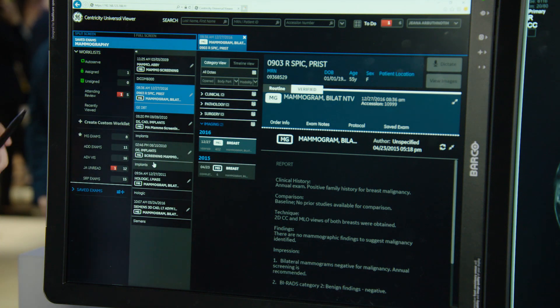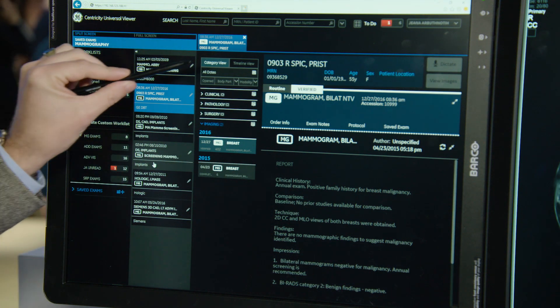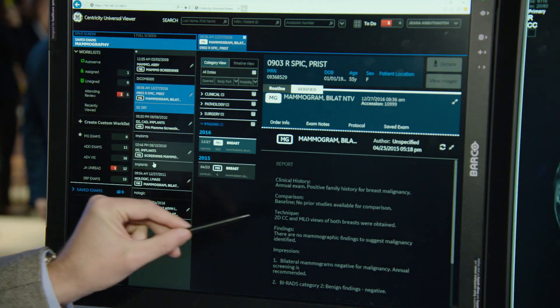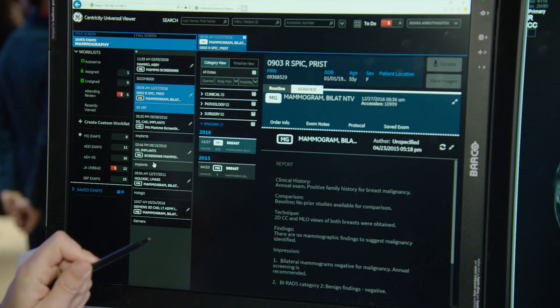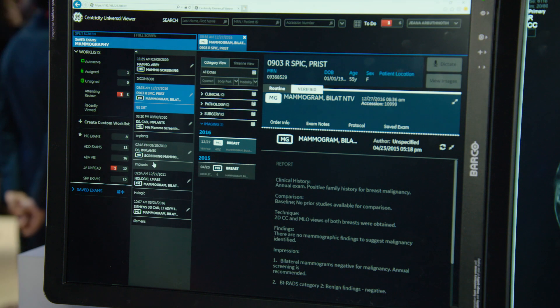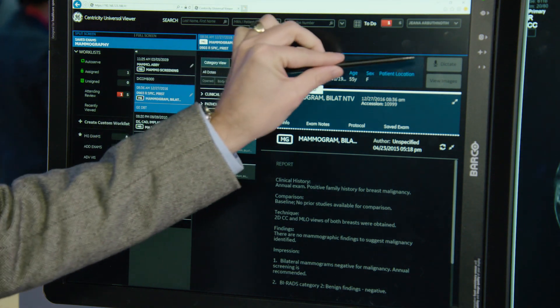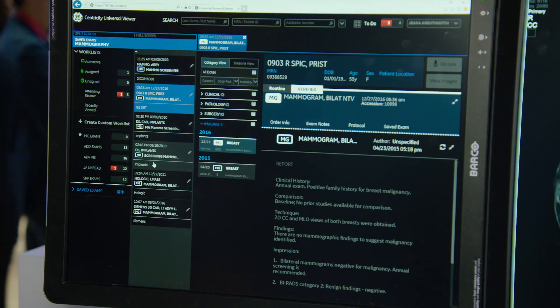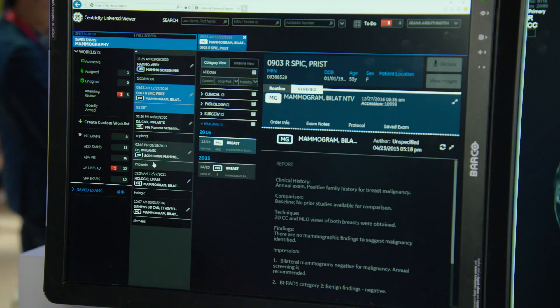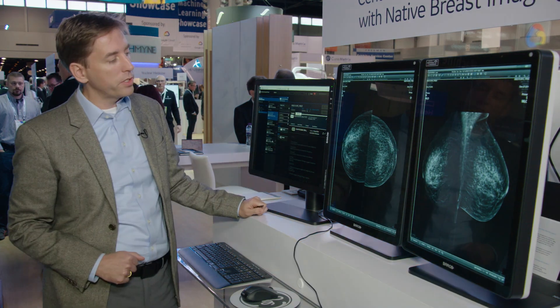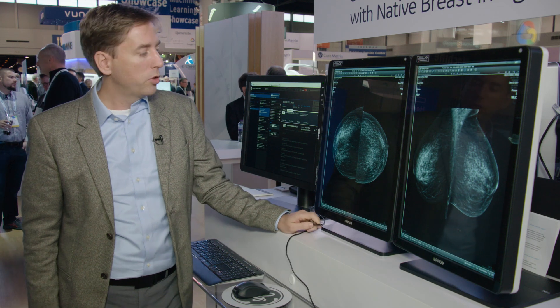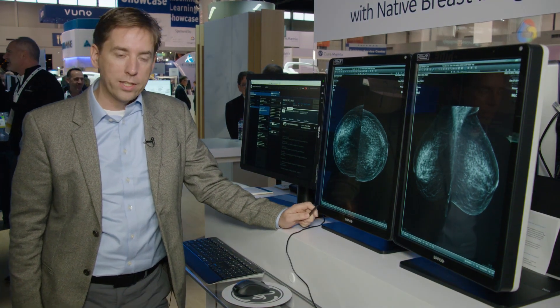Once you activate an exam, you see the diagnostic hub including the priors and the reports being streamed out of the EMR. The dictation system is integrated and the viewer is launched from this button to launch into the diagnostic setup. Once you launch the images, we go over to the embedded functionality to show you the mammography exams.